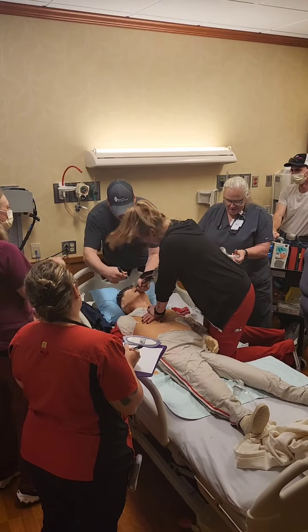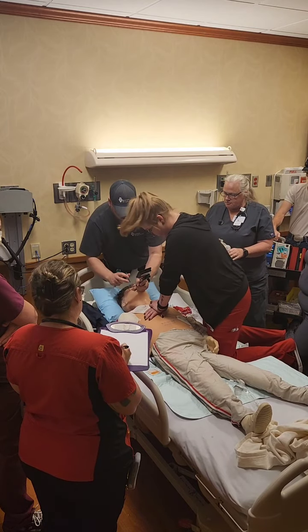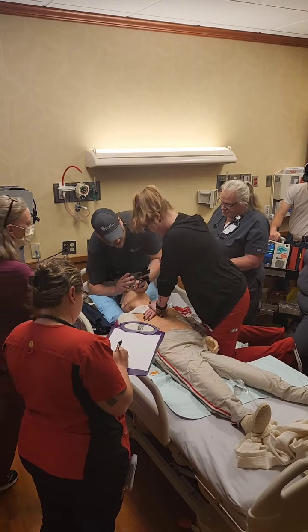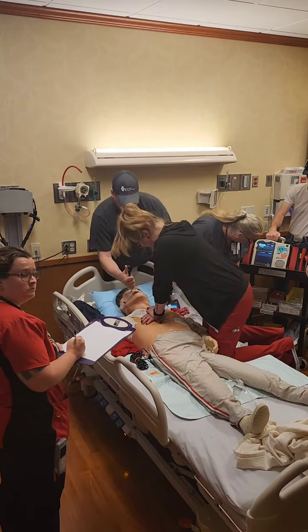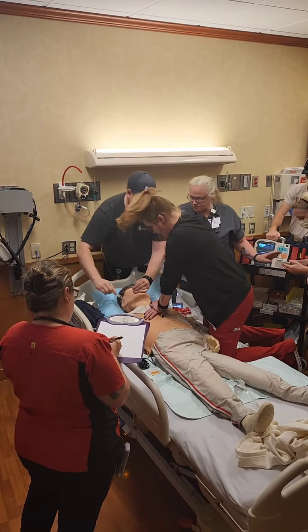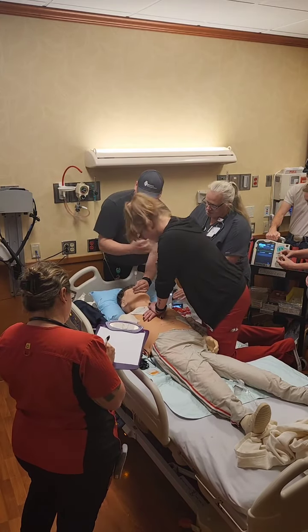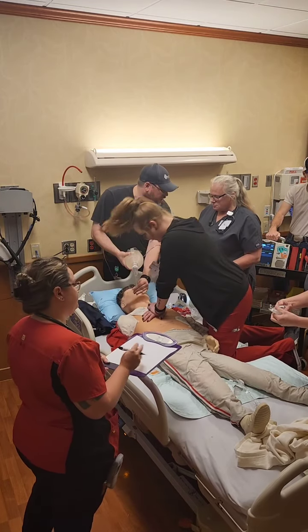All right, we got IO or IV. Patty, you let Liz go ahead and do that, please. We have an IV right here. Got Epi. Epi is right there on the cart. Who's Epi? Somebody want to grab the Epi, please? Oh, good. You're ready to shock, too? You got that bag ready? Is that the Epi? Okay, and flush. Let's shock.